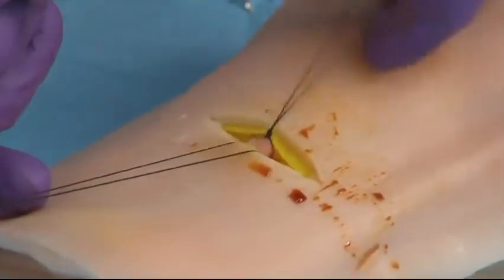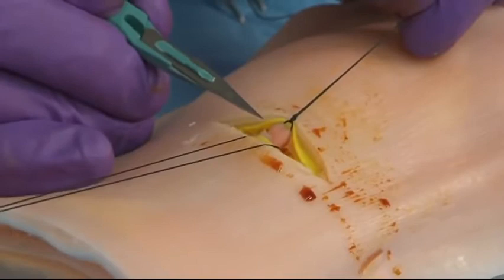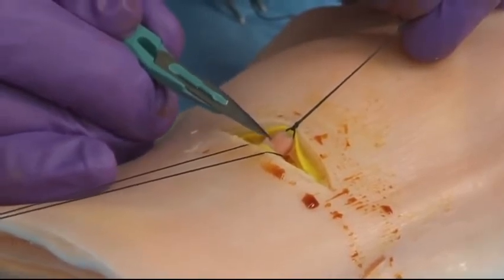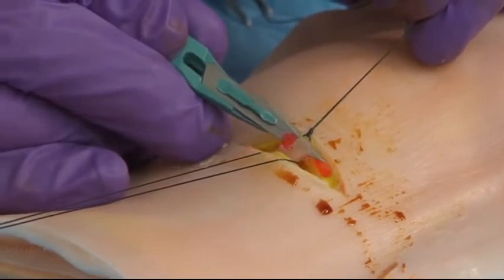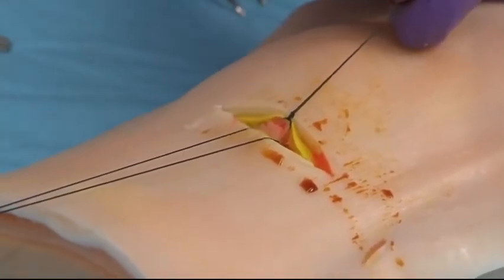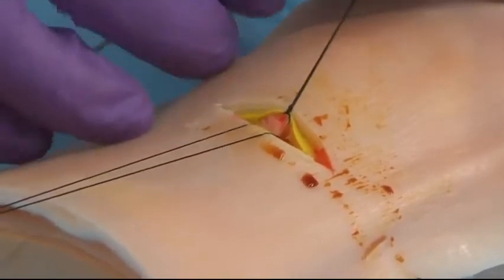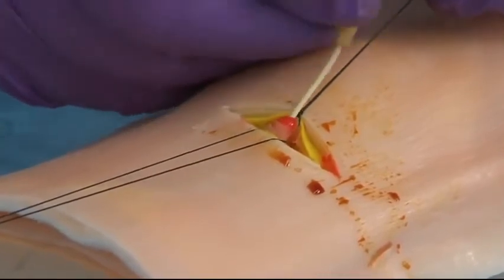Let's do that on the vessel. At this point, it's useful to have an assistant who can hold on to the suture for you on your vessel. I'm going to grab the other end of this and bring the vessel up into my field. Now I'm going to place the 11 blade perpendicular to the vessel through and through to the other side, and then angle it up and away. Now you see I've raised a bit of a flap there, and through this flap I can now place my angiocath, aiming it up towards the head.